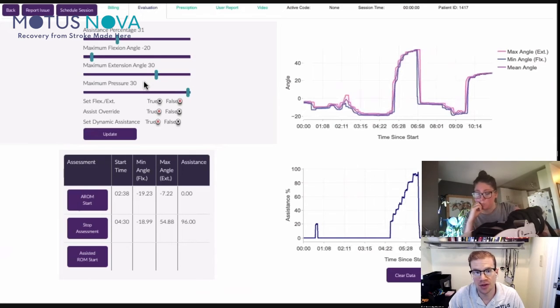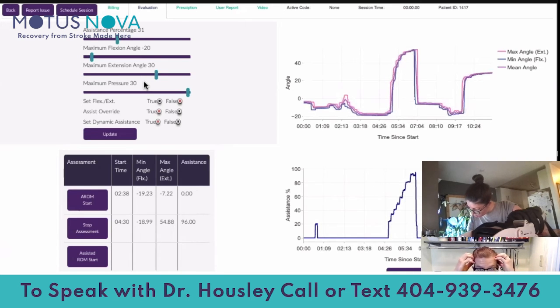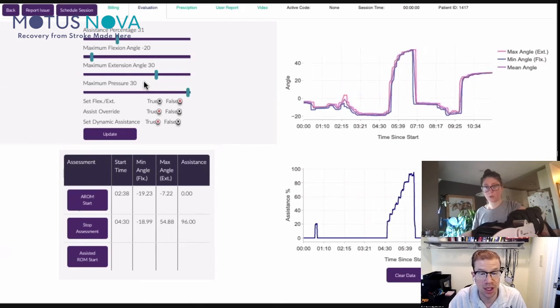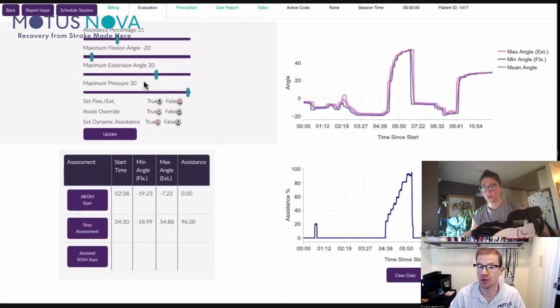Sure. So I think, Catherine, the process of closing your eyes is interesting, and it's good to test certain things. But fundamentally, if we want you to learn to map your intentions onto the correct movements again, we have to have feedback. Your brain has to have feedback about whether the consequence of the activation of those neurons is correct or not. To do that, we need that visual information being presented. As soon as we turned on your visual systems and you were looking at the data, you were able to move up more into extension. So when we have that visual feedback, we're able to check whether the thing we're doing is correct.